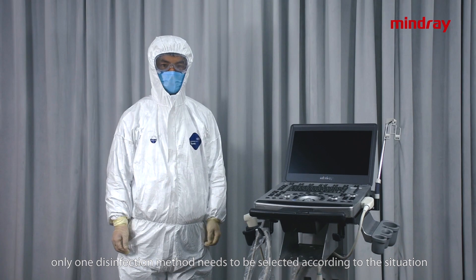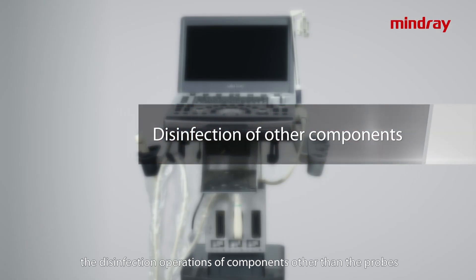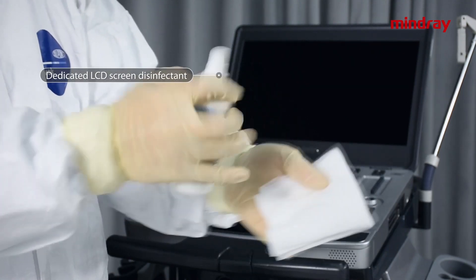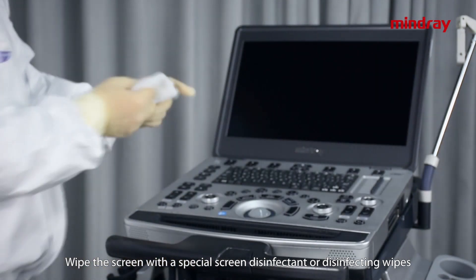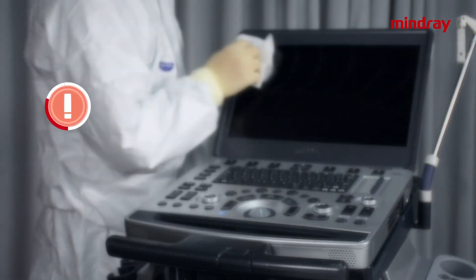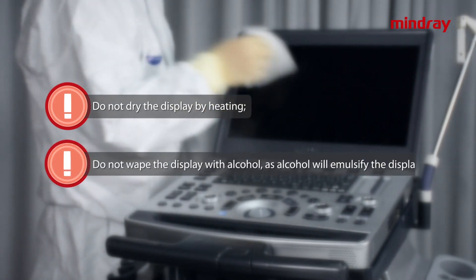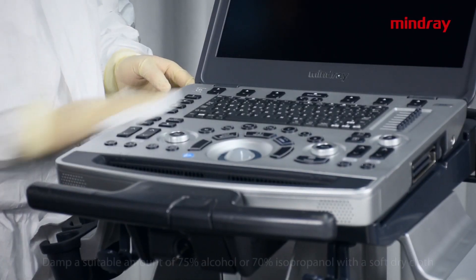The following will demonstrate the disinfection operations of components other than the probe. Monitor disinfection: wipe the screen with a special screen disinfectant or disinfecting wipes. Caution: air dry naturally after disinfection. Do not dry the display by heating, and do not wipe the display with alcohol as alcohol will emulsify the display.